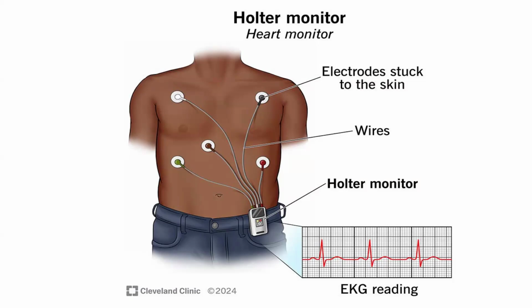So it's not always placed like this. Different manufacturers may give different directions on how to place the electrodes.